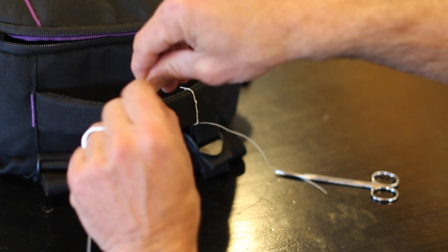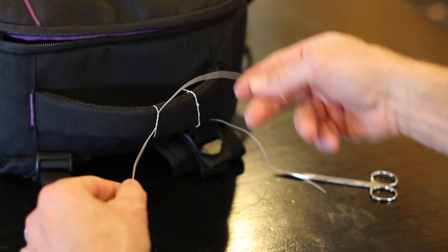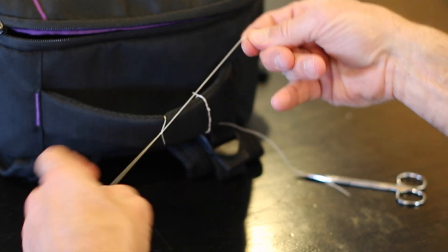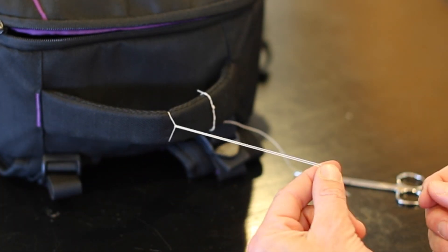Here's the surgeon's knot — one, two — and when I tie it tight, it stays tight a little bit better. That's how it looks on normal suture.